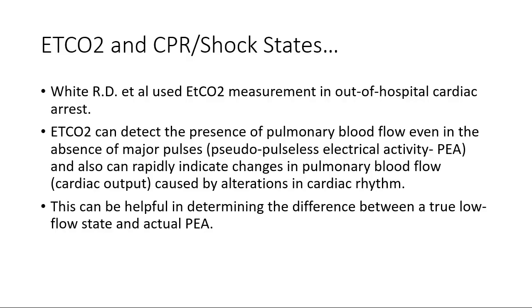So what about end-tidal CO2 with low perfusion states, such as shock and CPR? Well, they've been studied extensively. As long as you have some pulmonary blood flow, even if it's crappy, and you have some metabolic activity, you will still get a normal shaped waveform. It's just that the numbers might not be as high because you're not producing as much CO2. And here's the really neat thing.